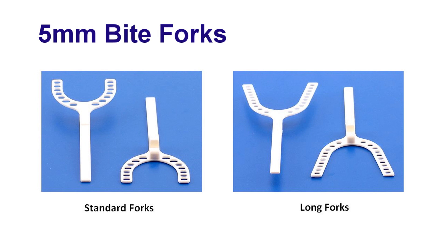The George Gauge comes with two sets of sizes. The white fork will indicate the 5mm incisal clearance once placed in the gauge. This is the one that is more commonly recommended for your sleep devices.